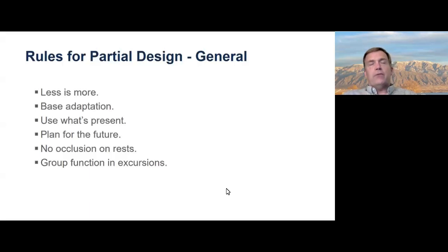Like we talked about last week, for a class 1 case especially, we'll probably want to do lingualized occlusion so that we have nice even forces, so that the occlusion isn't creating tipping forces. We want to make sure when the patient goes into different excursive movements that we check that on our denture teeth, so that way we don't have a lot of tipping forces.